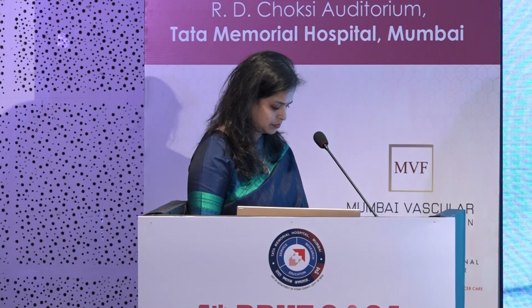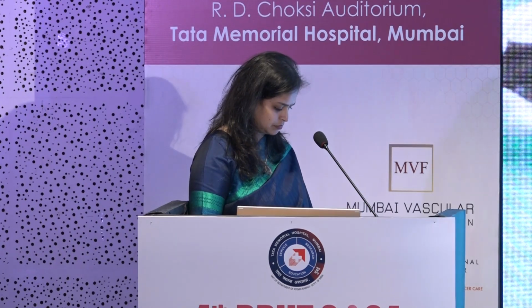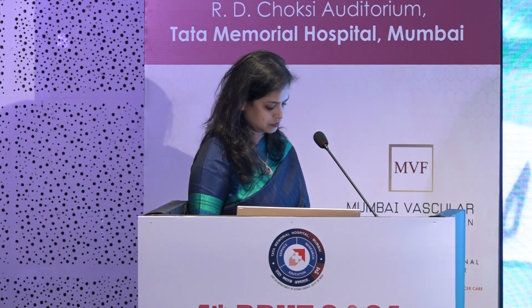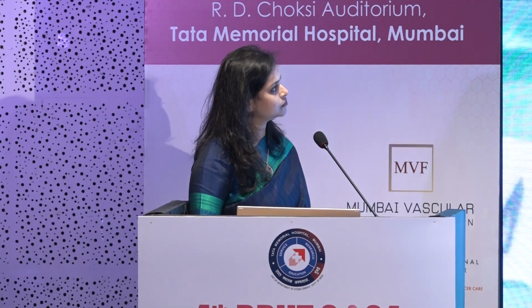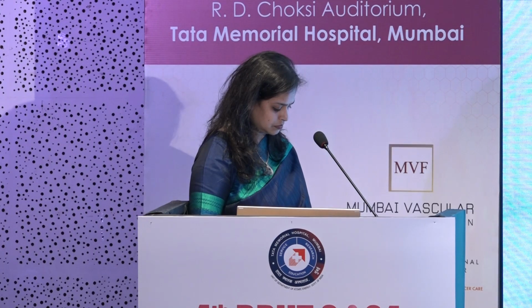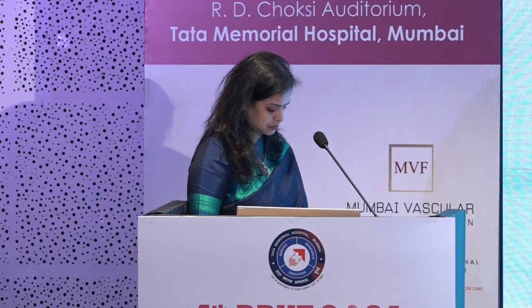Another thing that we always keep handy is a sterile plastic scale which remains in the sterilized disposable kit, so that if we need an assessment of the depth to be penetrated, we know. So I need to go at a distance of around 8.5 centimeters from this end. This will be about 6.5 centimeters. So I know visually I need to be about 1 inch outside the surface of the MRI grid so that I give adequate local anesthesia. This is important for the patient to be comfortable when the procedure is happening.